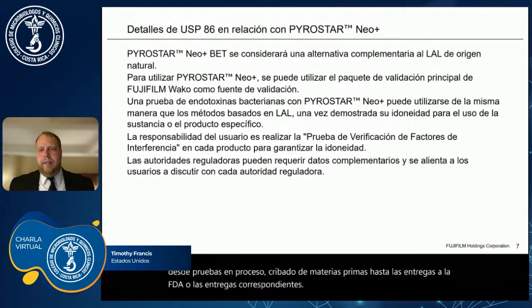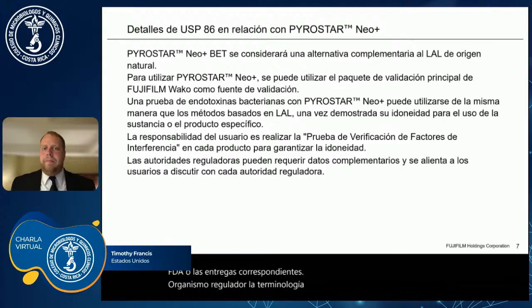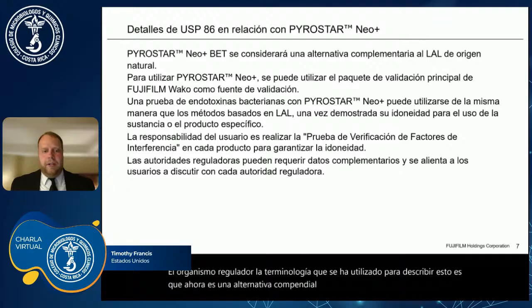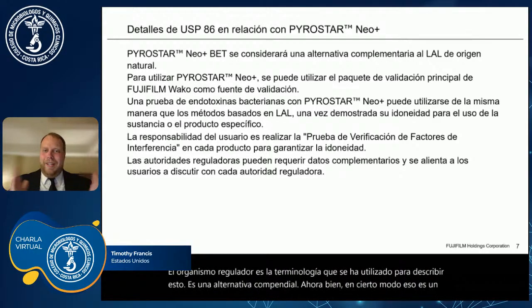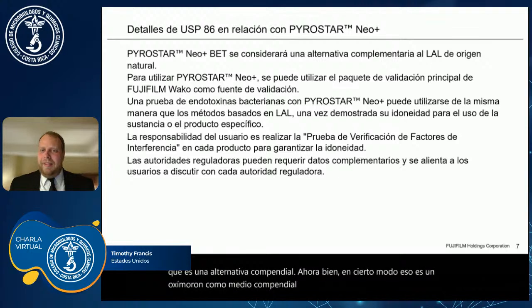The terminology that has been used to describe this is a compendial alternative. Now, in some ways, that's an oxymoron, as compendial and alternative mean almost the opposite thing.